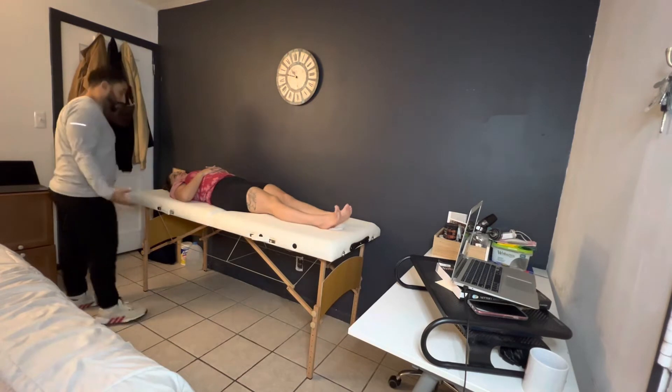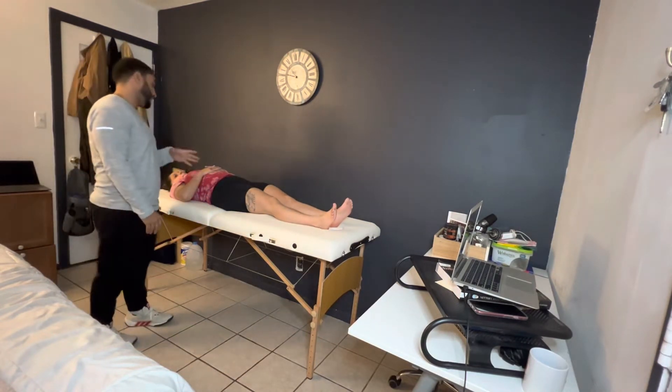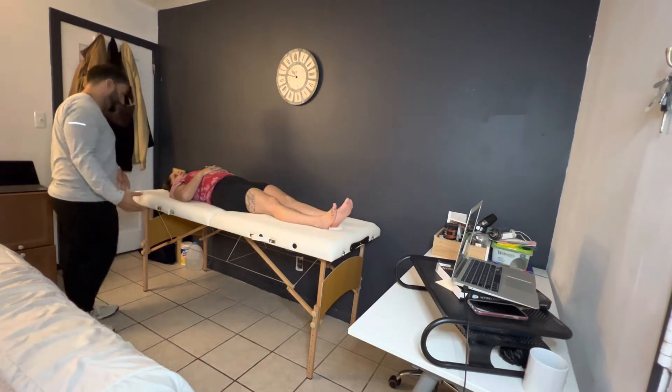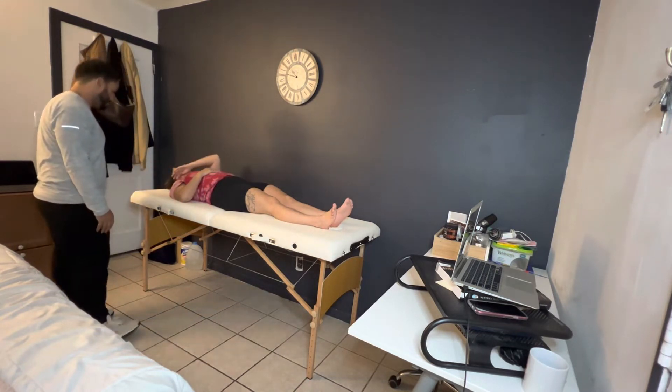Hello, Katherine. Thank you so much for coming back to the clinic. We're going to go ahead and keep checking out your knees, seeing how everything is feeling since the last time we were here. Have you been feeling good? Anything to update me on? Any incidents, any accidents, any injuries from the gym? All right, perfect.